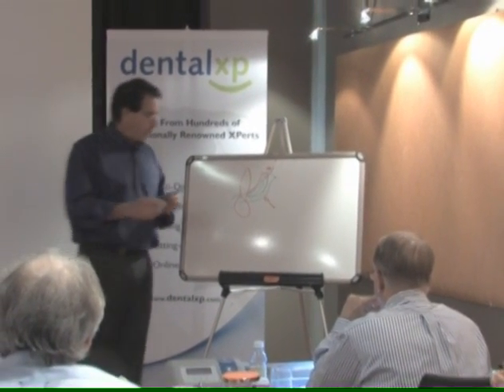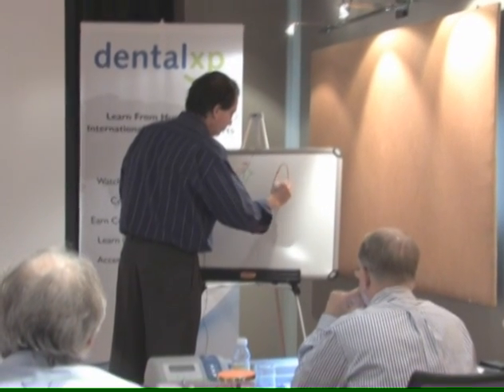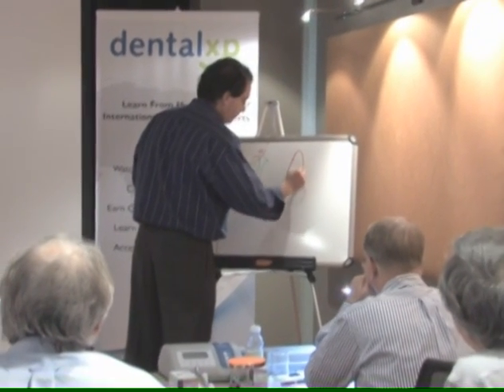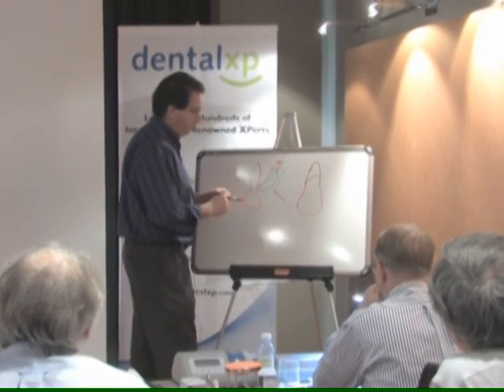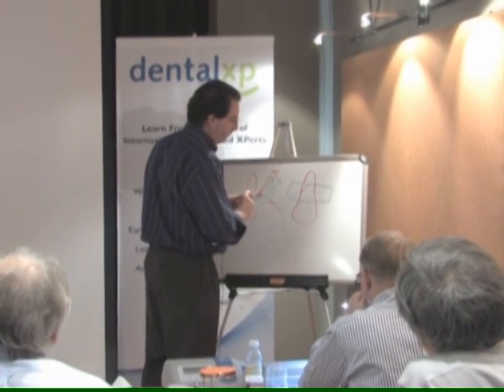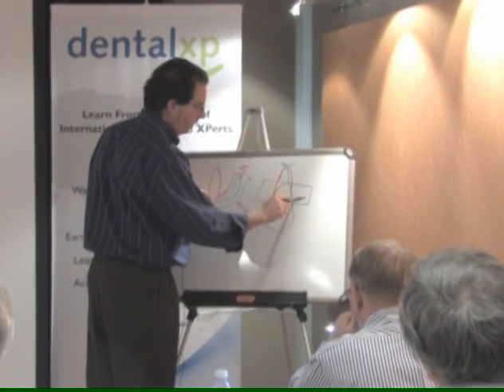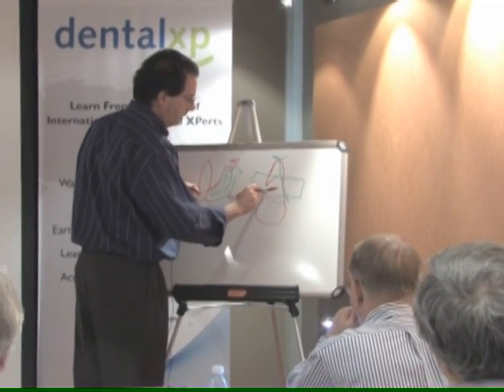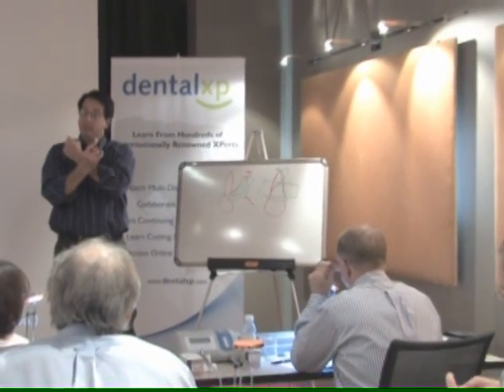So what we're ending up doing is a suture that, here's the tooth, we have recession down to here, we'd like to get the graft up to here. So we're putting in our graft, like so, and our suture is going to be picking up the periosteum deep, going over the graft this way, coming around, and tying. So it's like an X, okay? That X is pulling everything very closely.